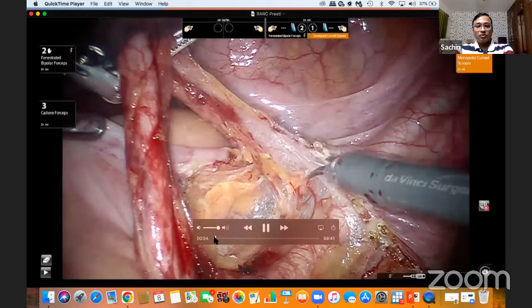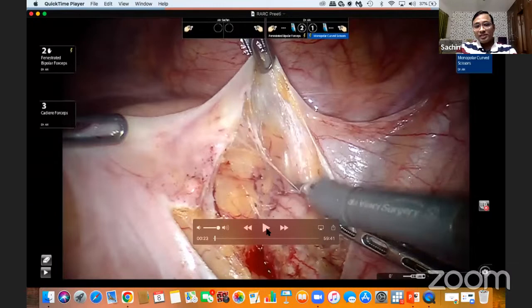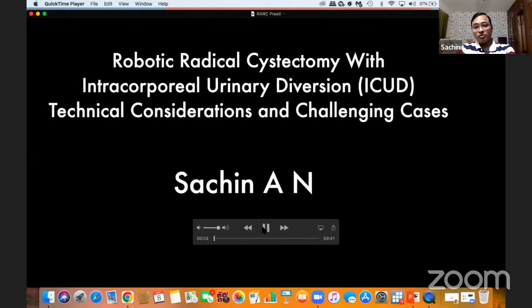the radical cystectomy is all about spaces. This is why we need these spaces: spaces are required to define the pedicles. The spaces in general consist of the periureteral space, prerectal space, perivesical space, and antevesical space. So the first thing we do is develop all the spaces so that we define the pedicles of the bladder.